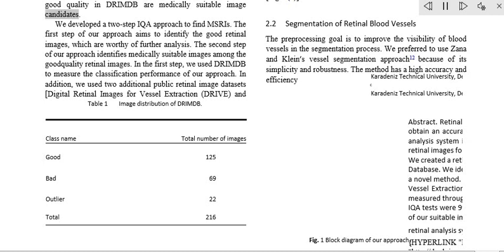Figure 2, Blood vessel segmentation phases. A. Original green channel retinal image. B. Applying contrast-limited adaptive histogram equalization transform to inverse of green channel retinal image. C. Applying the morphological methods. D. Binarization of C with a triangle automatic threshold method. E. Removal of small regions without vessels. And F. Overlaying the segmented vessels on the original green channel retinal image.